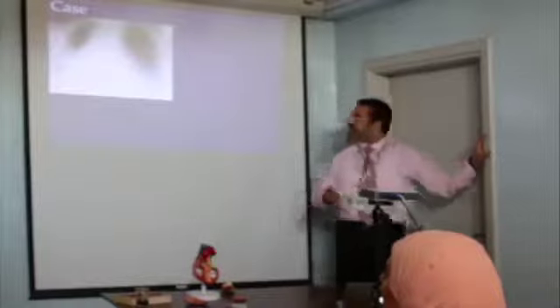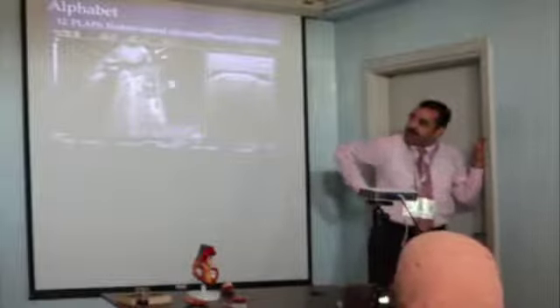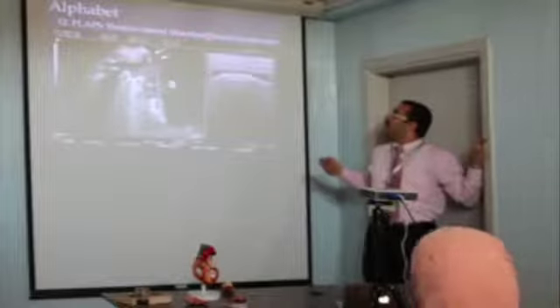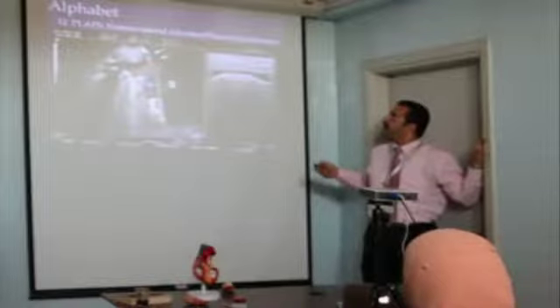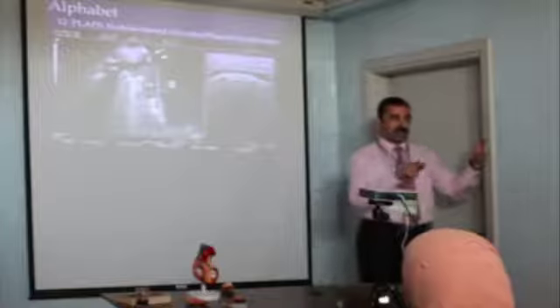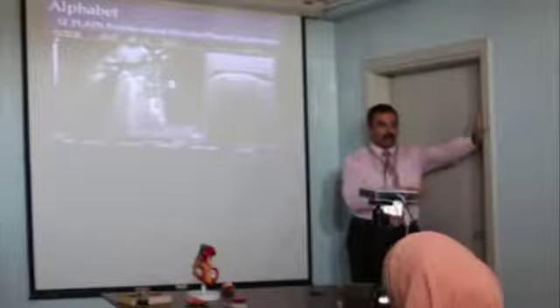PLAPS, perfect. PLAPS is posterolateral, related to the site of application of your probe. We'll see that in a minute. And it's alveolar plus or minus pleural syndrome. So this is alveolar and this is pleural. Thickened pleura with underlying consolidation is diagnostic of chest infection or pneumonia. There's an inflammatory process behind. Okay?